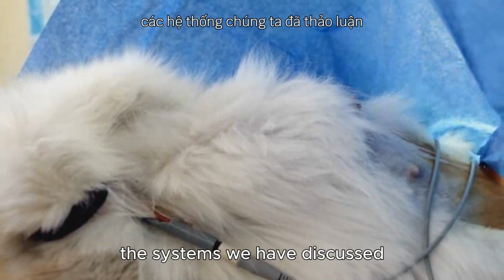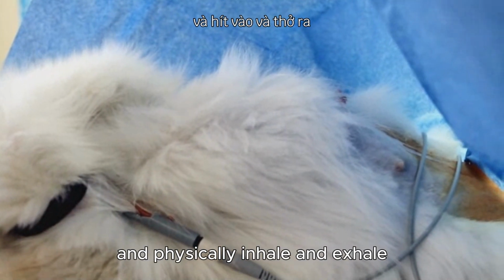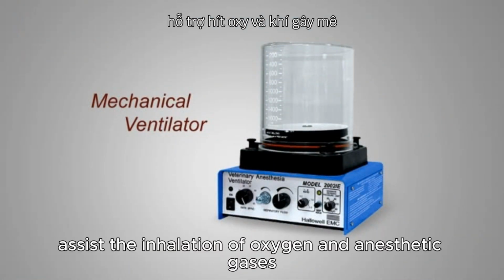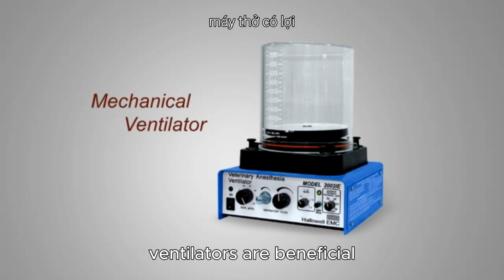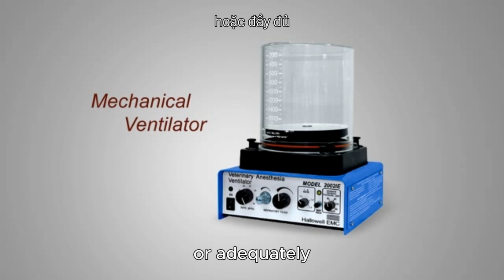The systems we have discussed rely on the animal to spontaneously and physically inhale and exhale in order to make the breathing system work. Mechanical ventilators assist the inhalation of oxygen and anesthetic gases by forcing the gases into the patient's airways. Ventilators are beneficial for the patient that is not breathing regularly or adequately.